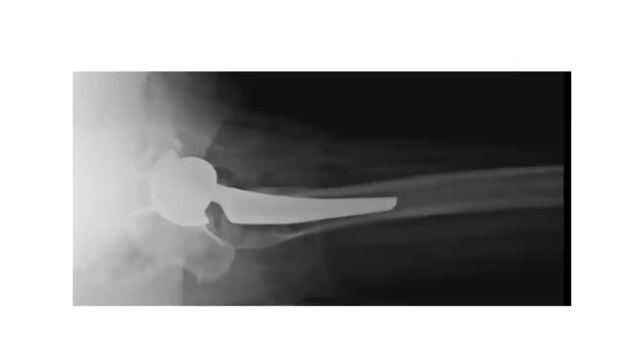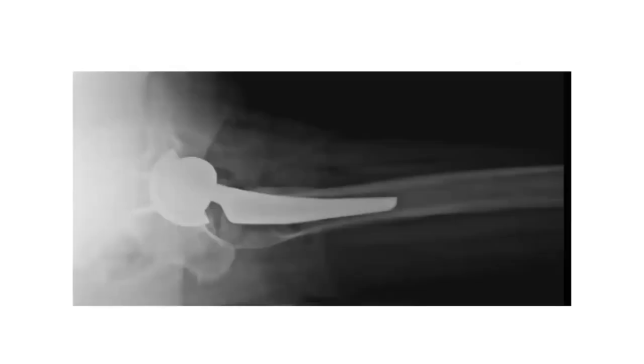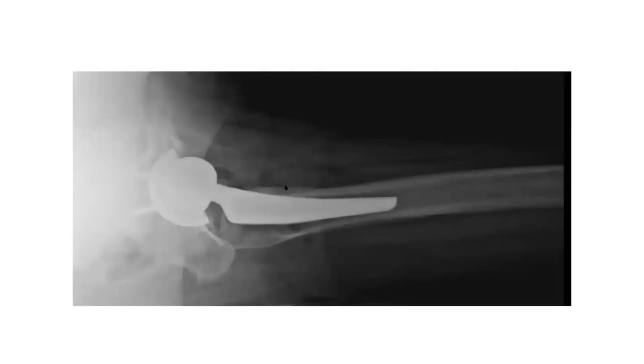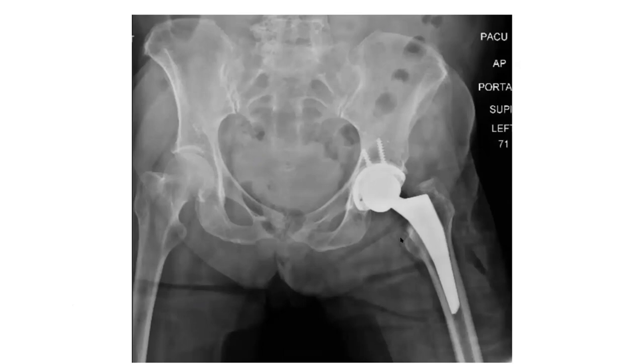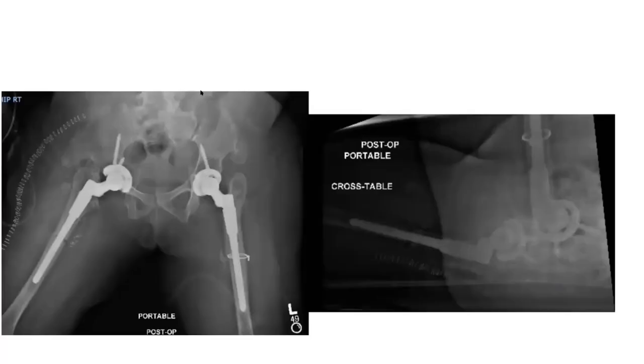I don't know, it might be subtle, but what do you think this is? Let's see. Uncemented, partially coated. It seems to be a dual wedge? Yeah, so that's a double wedge. You just got to look at more of it. But you see how it fills up more of that metaphysis than the single wedge did, looking at the lateral and AP. I'm liking it. Okay, what about this one?